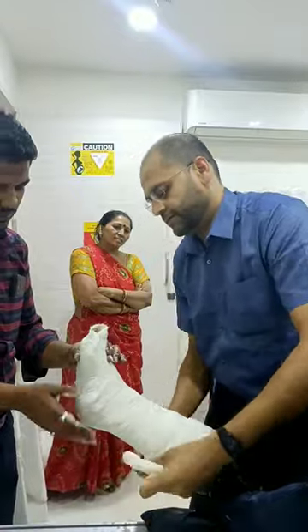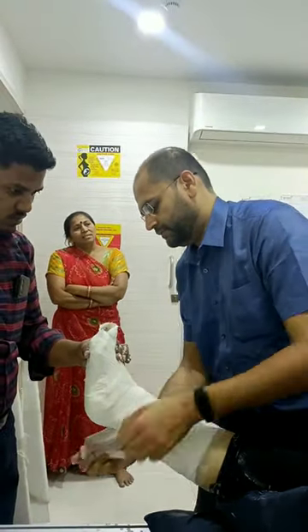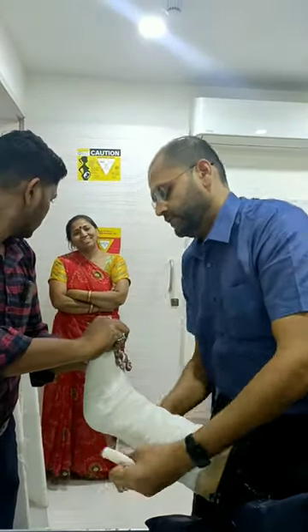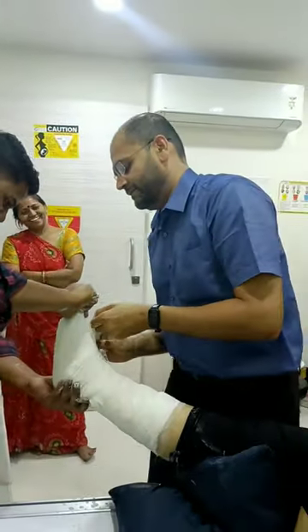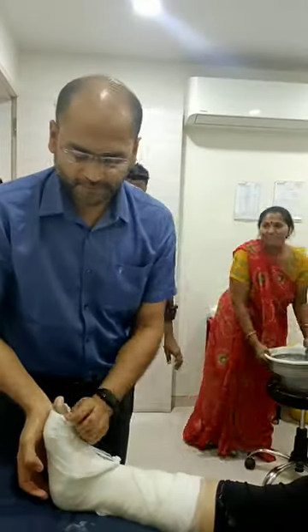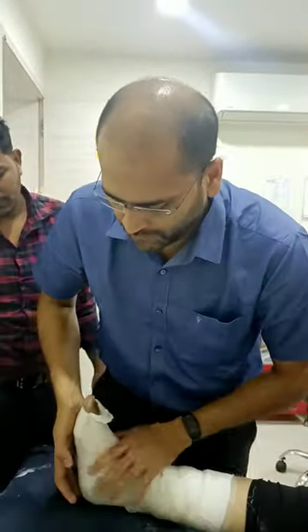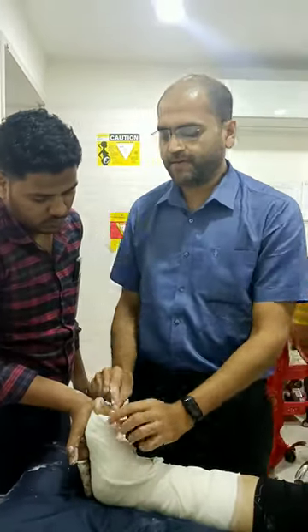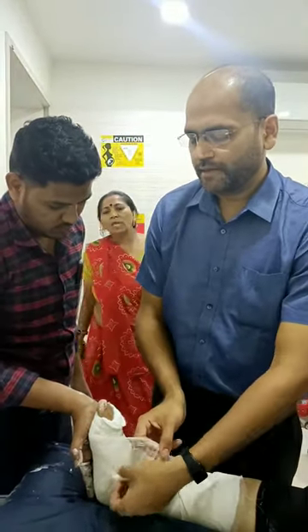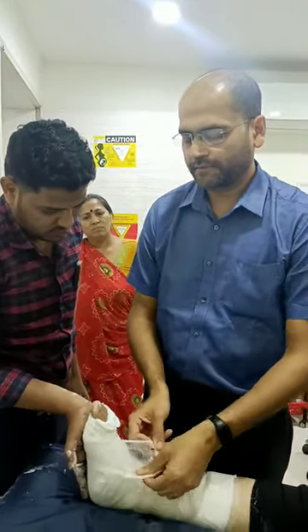There are two ways in which we can apply a plaster to a limb. In a slab, we are applying the plaster to only one aspect of the limb and it is secured with cotton bandage. While in a cast, we are applying the plaster in a circumferential manner. A slab is applied in an acute setting where there is significant swelling, whereas a cast is applied when the swelling has subsided.